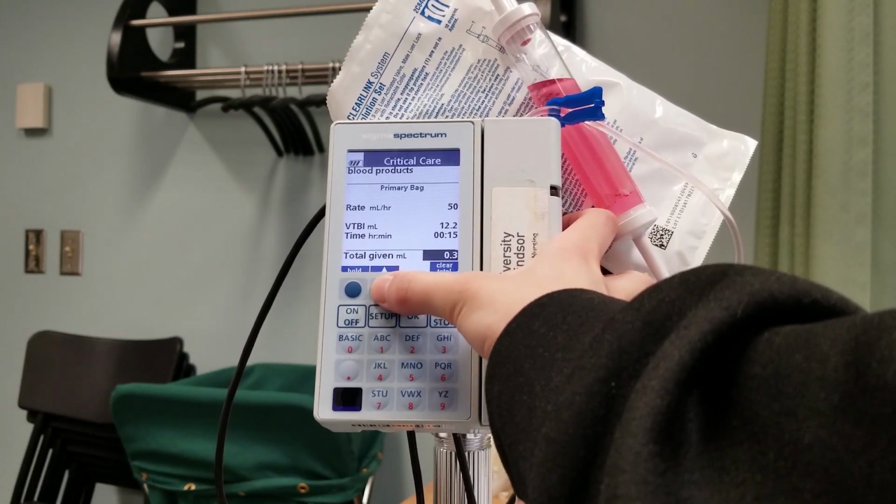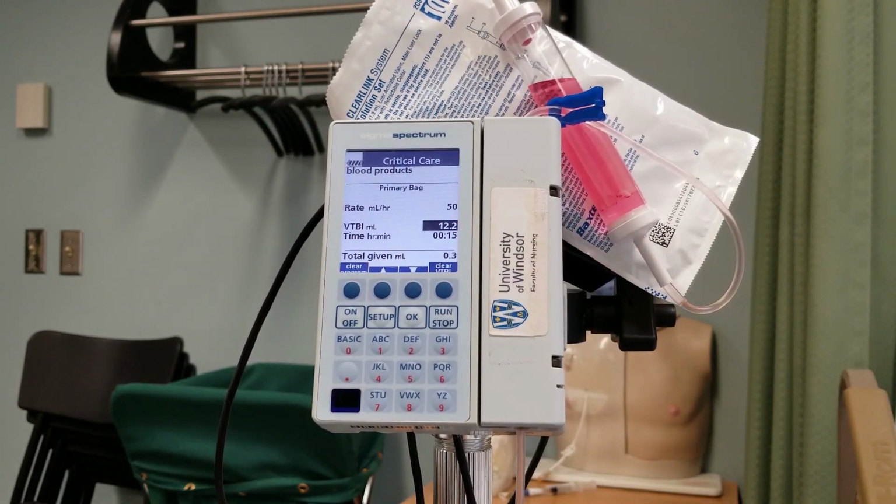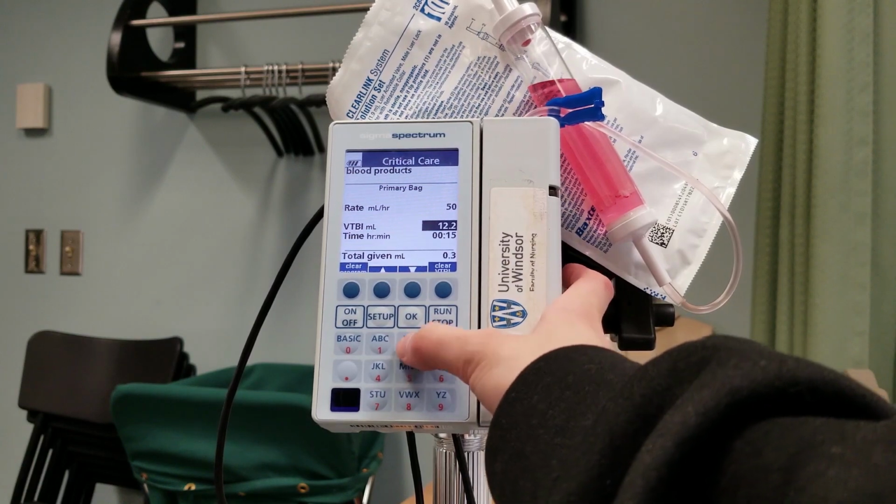And I'm going to go up. I'm going to avoid changing my rate because as we saw with our math, our rate turned out to be a very long decimal. So I'm going to let the pump auto-calculate that, and I'm going to start with my VTBI, which we ended up finding was 237.5. I'm going to round that up to 238.